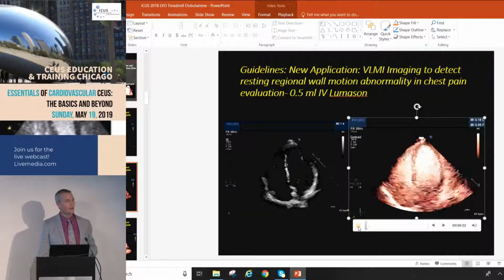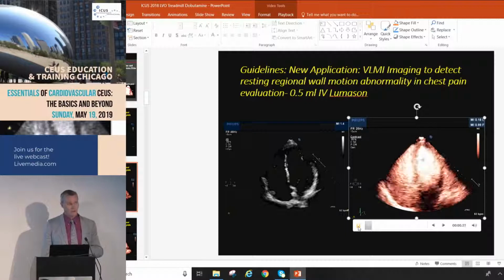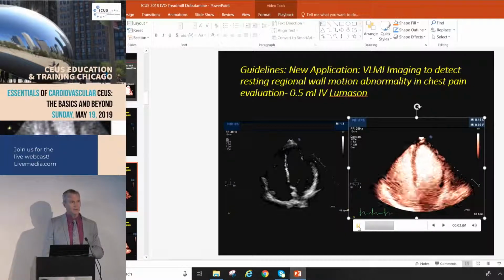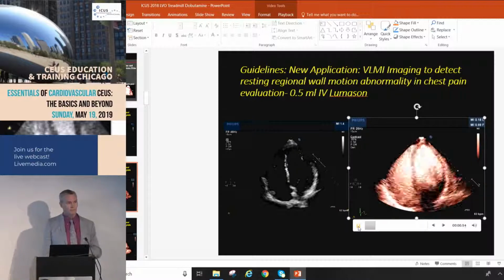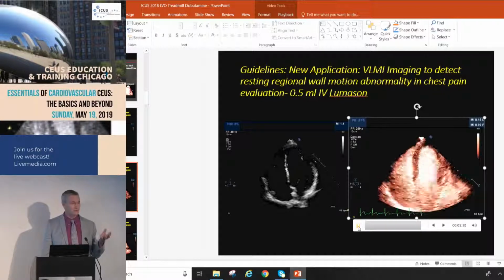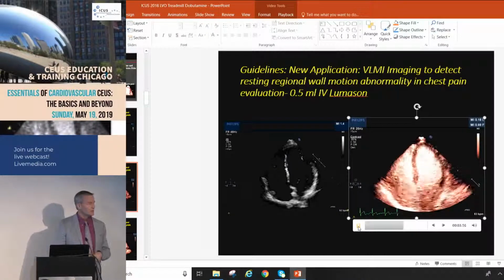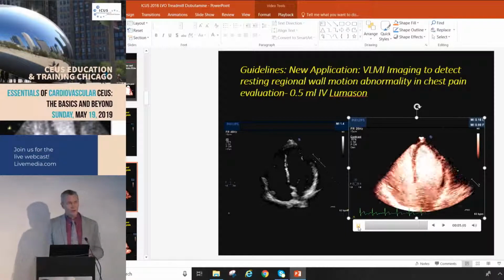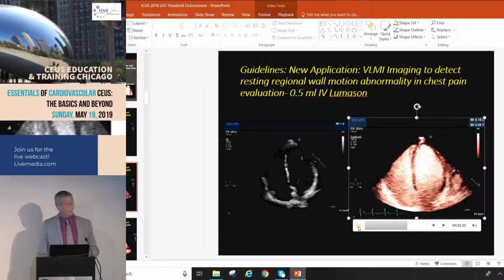Then how do you use it? Do you use harmonic or do you use this very low MI? Low MI, being low MI harmonic? Low MI harmonic. Okay. We even go down way to 0.07. But then don't you lose a lot if you're using harmonic? Don't you lose a lot of contrast? No. Okay, because the very low MI. Yes, we use that too. Yes, we have that software. So low MI and low MI.